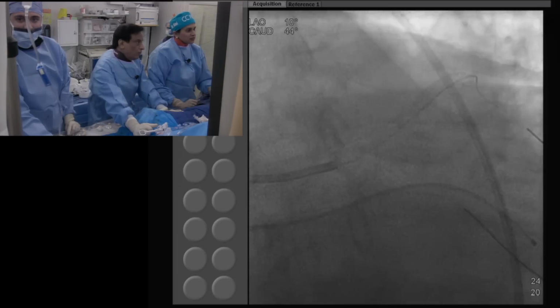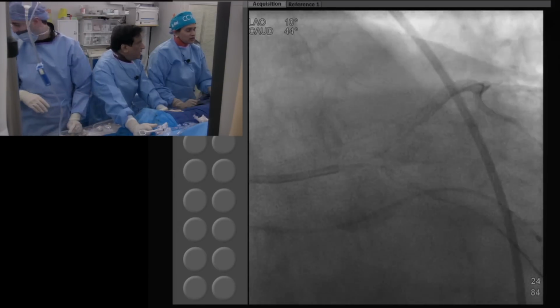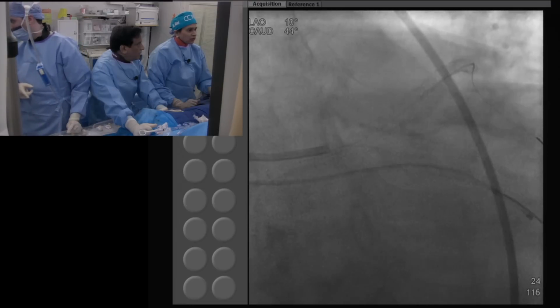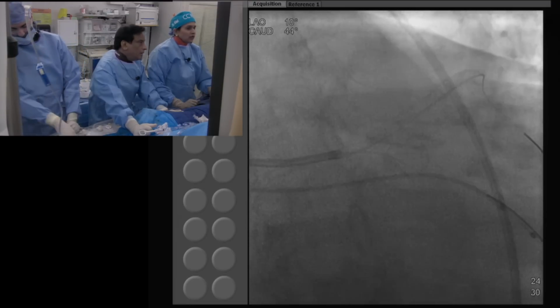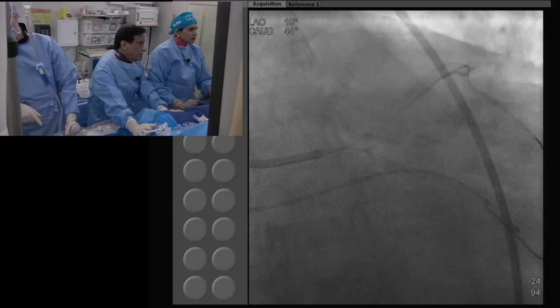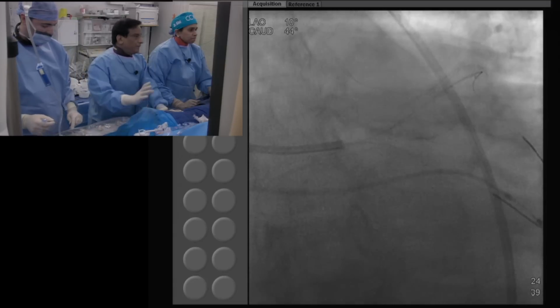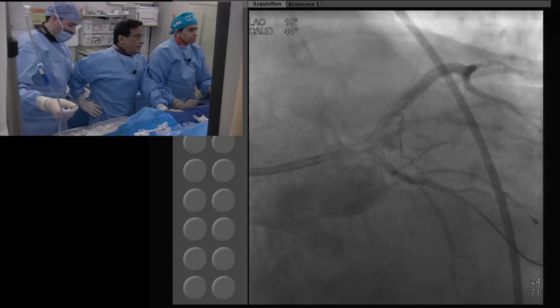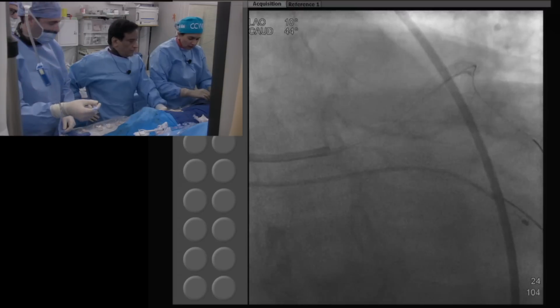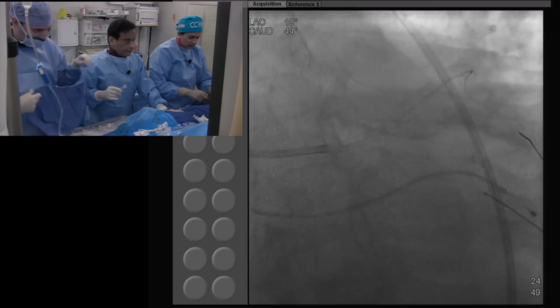You make it a 40-20. No. Why? See, you have to give a gap. Otherwise, you will be double layering the diag and you'll close the diag. Okay, that's a big diag there. Okay, then just do this. If needed, we will decide on a 16. If there is a gap, then leave it. We'll deal with it later. Let's see. 12 will cover it. Otherwise, have a 16 ready, possibly 16.